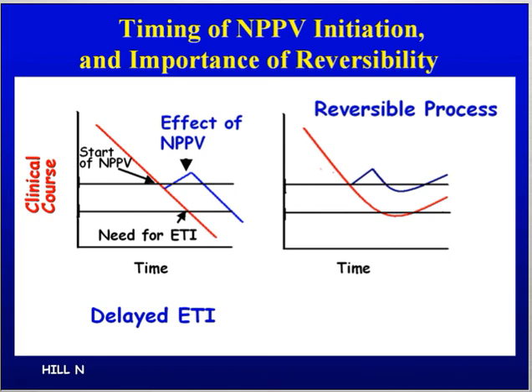Very short question. Laurent, how important is patient-ventilator desynchrony to success in non-invasive mechanical ventilation? We don't know. So that could be a short answer. This is a major topic to study.